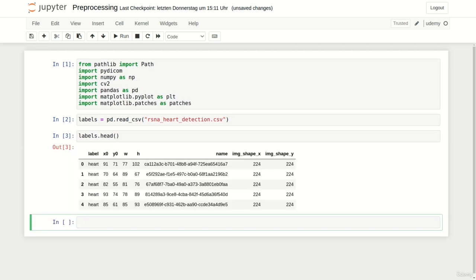Let us have a look at some entries. You can see that our labels file contains the coordinates x0 and y0 which correspond to the top left corner of the bounding box. Next to that it contains the width and height of the bounding box. This defines the location of the heart in a unique manner.